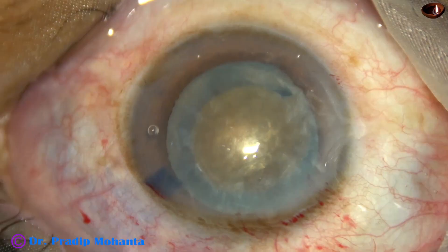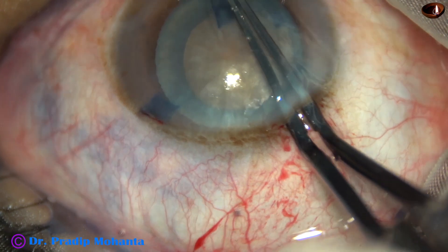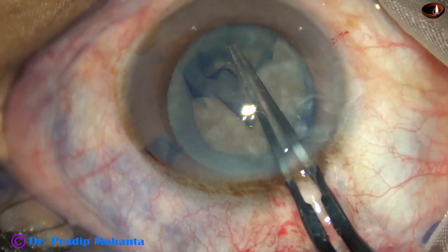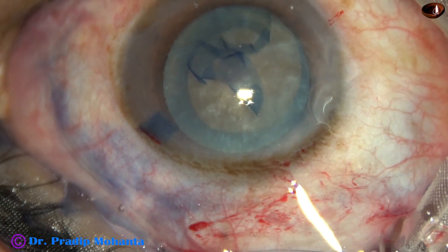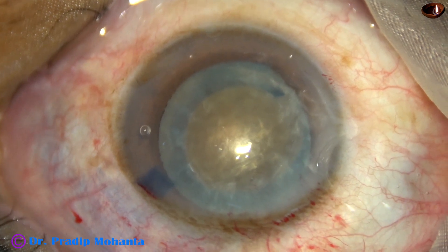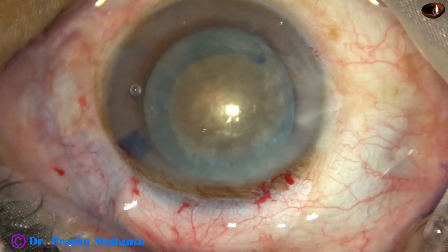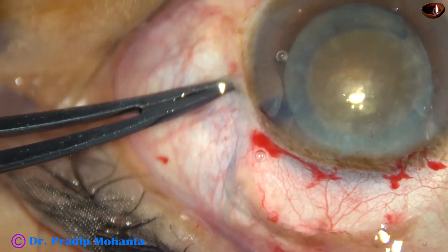This is another case — hard cataract, grade 4+. The rhexis was going nicely, but suddenly the rhexis runs out at 7 o'clock and it could not be retrieved. In this case also, the right move is to convert to SICS. Since this is a hard cataract, the tunnel length should be at least 7 mm.